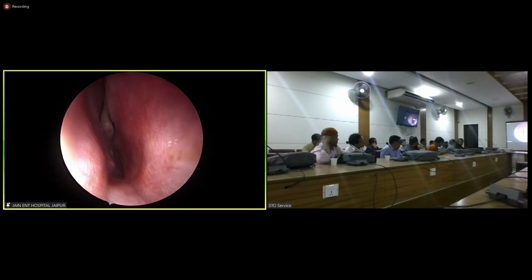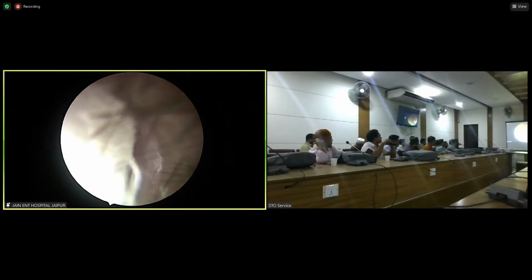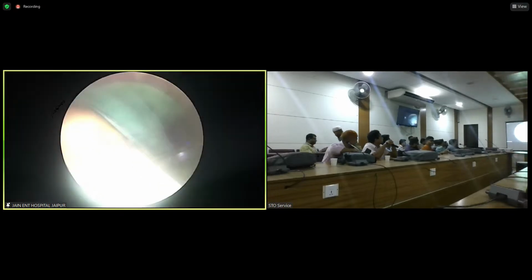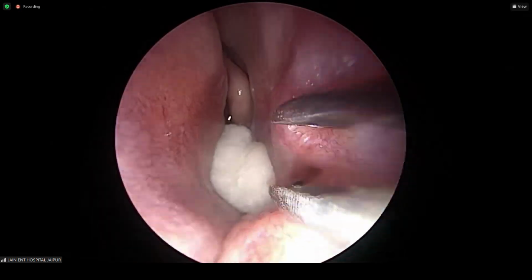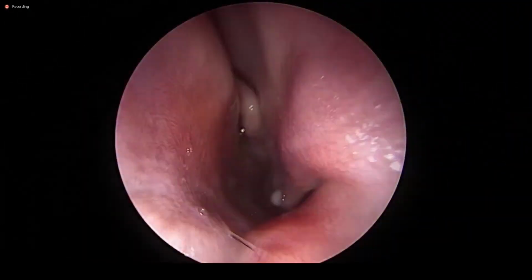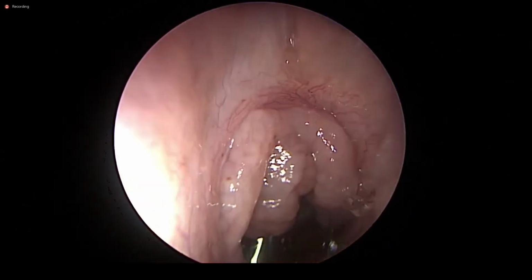See this. This is the right nasal cavity of a young child. This is the left nasal cavity, and we packed it with the saline adrenaline solution to open up the nose, to decongest this and improve the nasal passage for our instrumentation. Can you see that? Yes, sir. And these are the adenoids after decongestion.